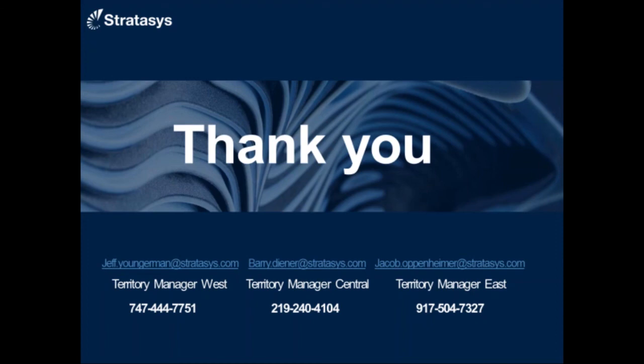Cody, if you could handle more of the splitting of that file and how that works, please. I'll expand on what you were talking about. We design and print in the same day. We also mill, or do whatever we need to do with the restoration, the same day they're designed. So we do them in batches. The way the printer works, in order to save as much time for each process, is that it makes passes across each portion of the grid.